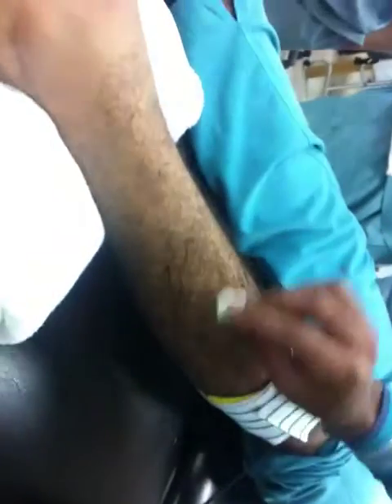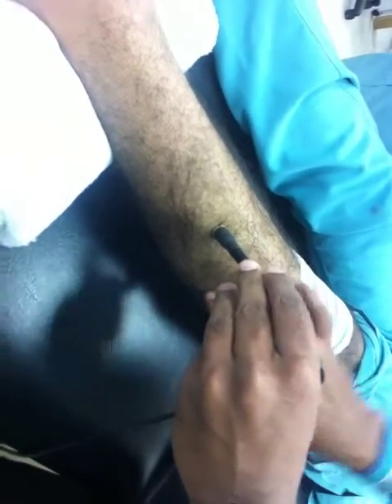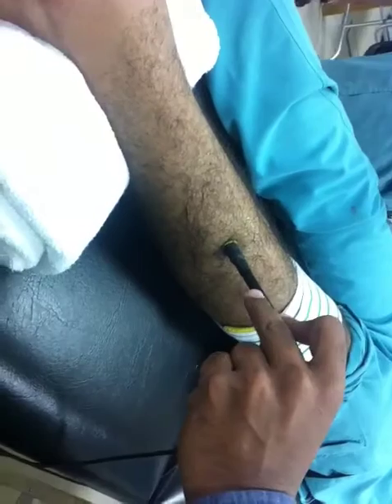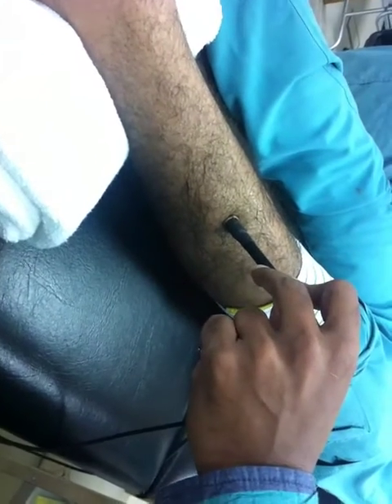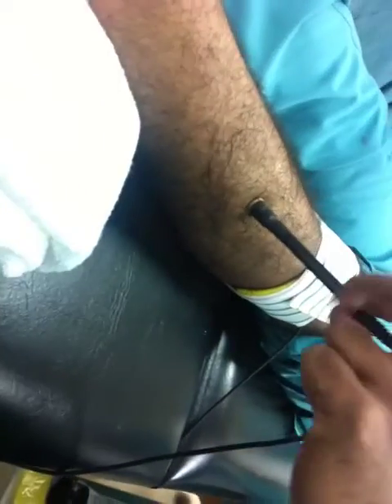Next is extensor digitorum longus. Extensor digitorum longus produces extension of the digits with movement of the ankle — extension of the ankle with extension means dorsiflexion. Only in the leg you will have all extensors at the anterior aspect and flexors at the posterior.